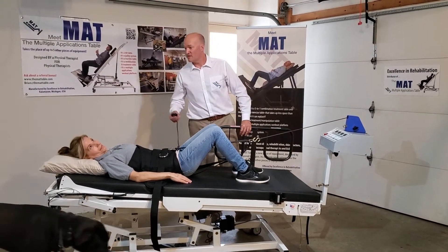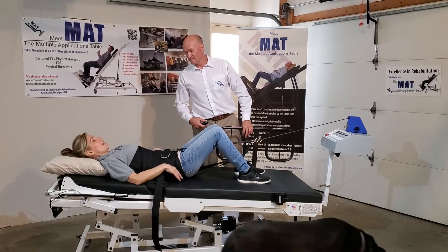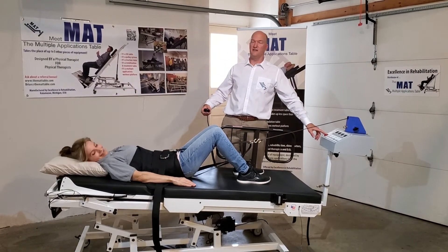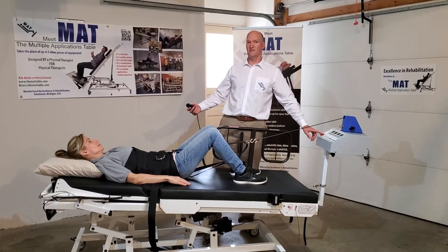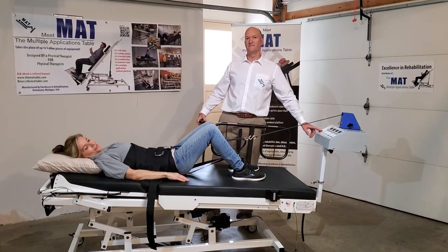Patient S, does everything feel okay? Are you comfortable? I already feel relief. And we hit the on button and traction begins. Mechanical lumbar traction on the mat table. Thank you.